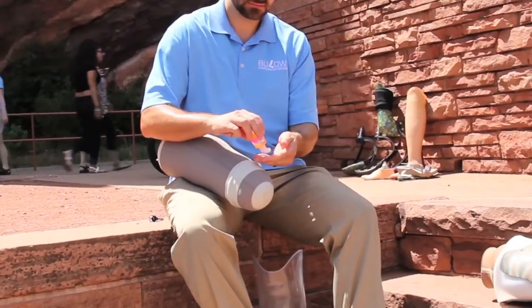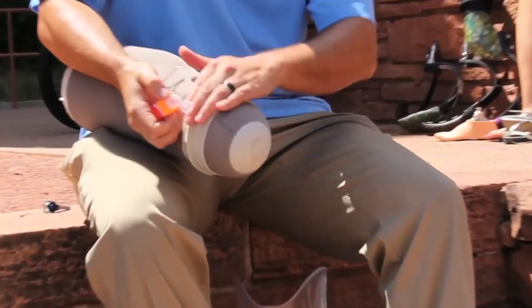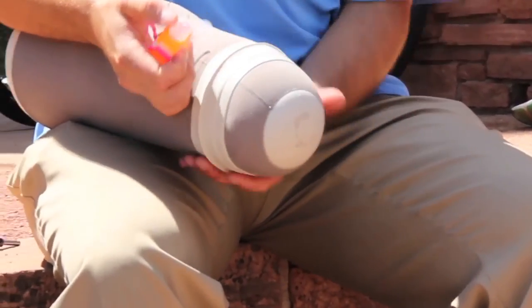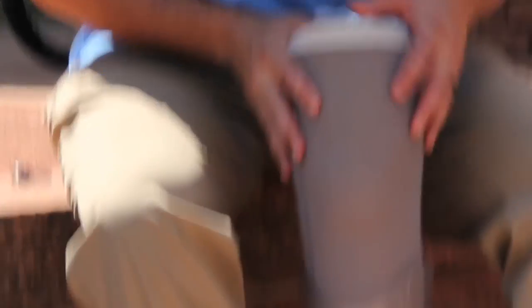When there is pressure within the prosthetic socket, the gel in the liner works by distributing pressure more evenly around the residual limb. The gel also helps to reduce friction against the skin that may occur while walking.